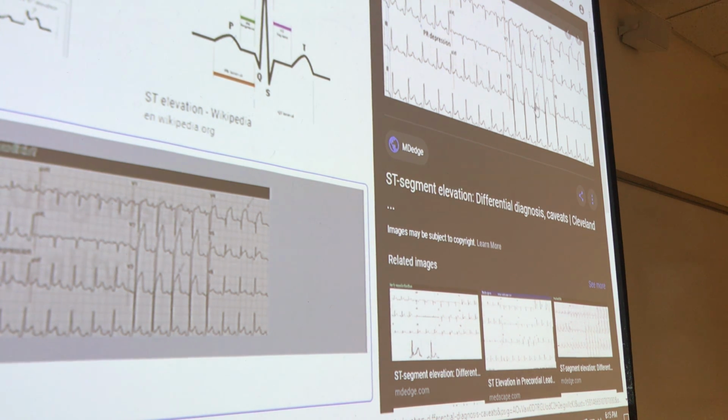When we see this, and then we see somebody also complaining of chest pain, and then we see somebody also having a rise in the troponin levels when we do a blood test, immediately, that's the gold standard of having a diagnosis of an active myocardial infarct. The problem is this: once you have this, your cardiac muscles don't heal. They don't repair themselves. They don't regenerate. So once you've had this situation, from that day on, your ECG will be very different than what it was a day before, before you've had an MI.